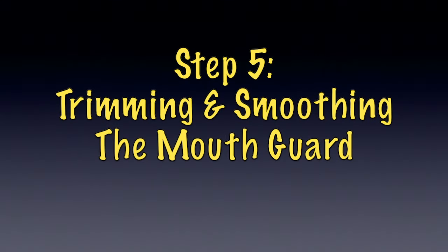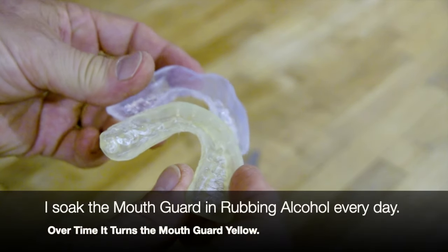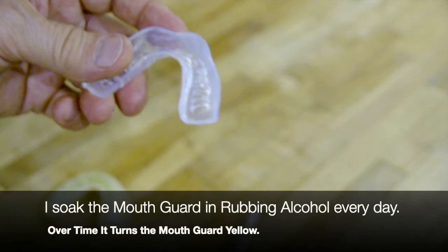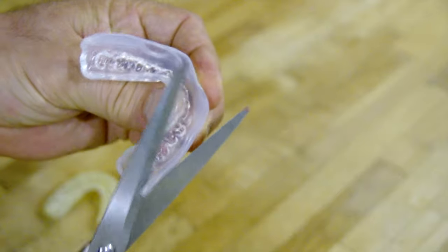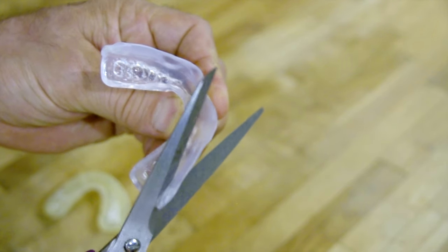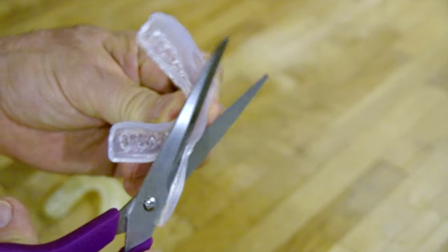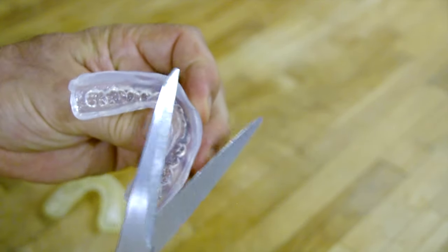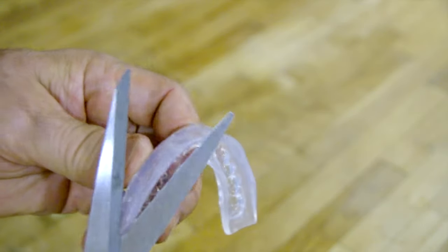This is my old mouth guard, and you can see compared to the new one I trimmed down quite a bit of the edges. I'm going to show you how I do that right now. I start back here with the scissors, then come in with a dremel or sandpaper to smooth it out. You want to make it as small as possible so you can keep it in your mouth all night long, but we'll sand it because those edges can be a little bit sharp.